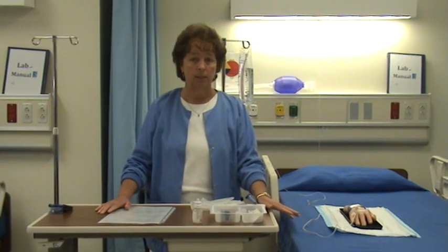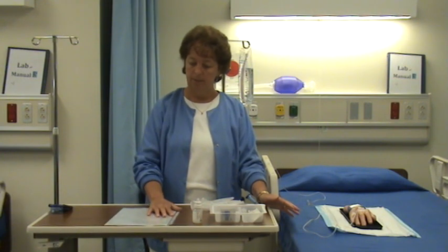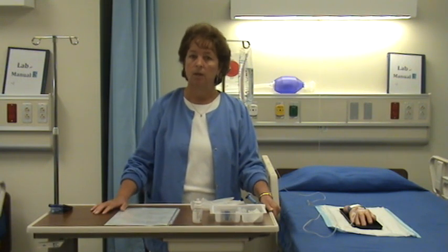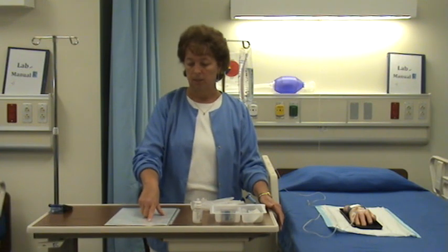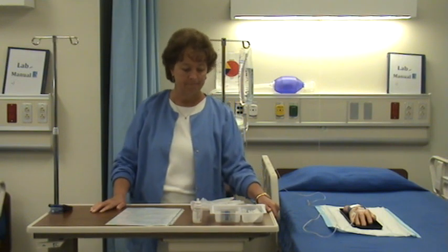Does it need to be diluted? And it doesn't. And how fast can I give it? When I look up Lasix IV, it says I can give it over 1 to 2 minutes. And it's the lower side of the dosage, so I'm going to give the 20 milligrams over 1 minute.